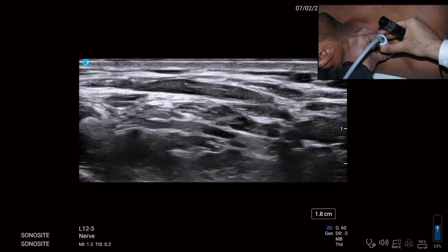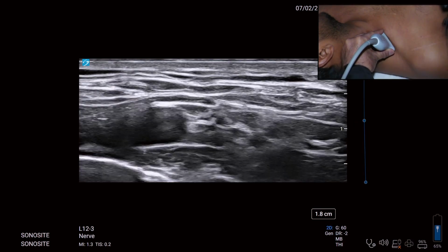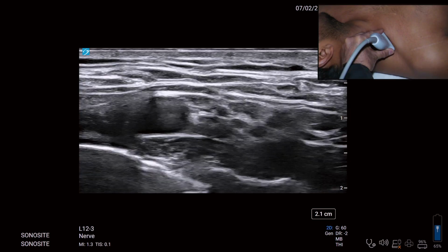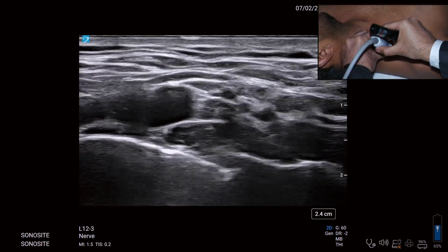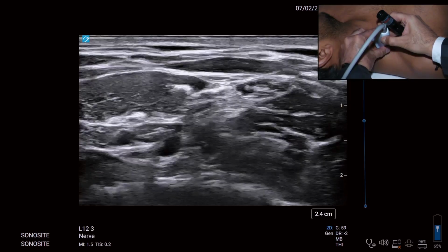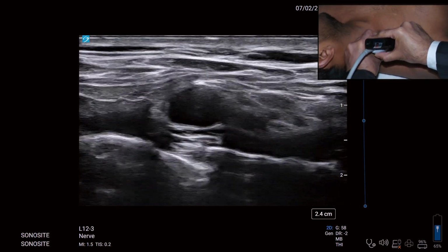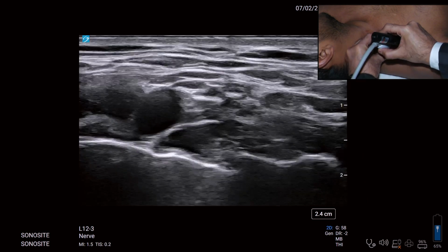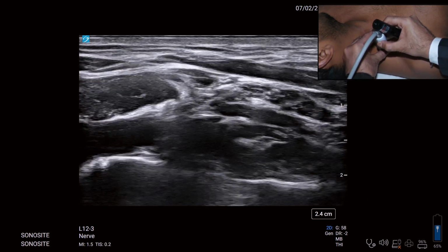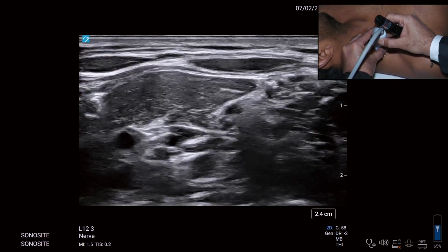I move back to the clavicle and again I ask him to increase the depth. So the entire brachial plexus is situated here. Now we are not able to see the C8, T1. I'll try my level best. All times we are not able to appreciate it, but it's located just in that pocket. So the vessel can be appreciated by all. Dorsal scapular. I go up.